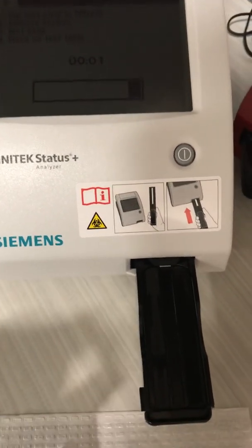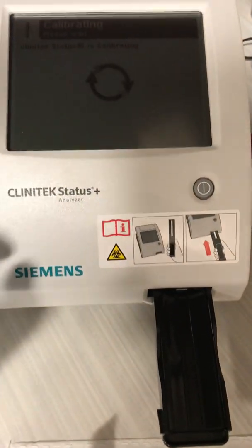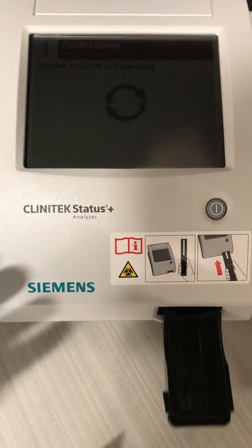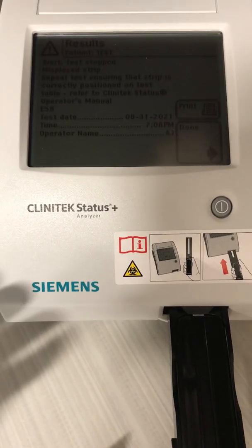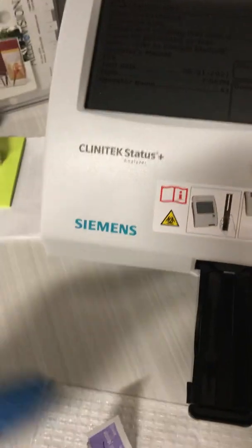It will read for about eight seconds, giving you enough time to put the strip in, make sure the urine is on it, and let it run. The same process applies to the microalbumin — it will give you a sample. I already ran the sample and it prints out like this.